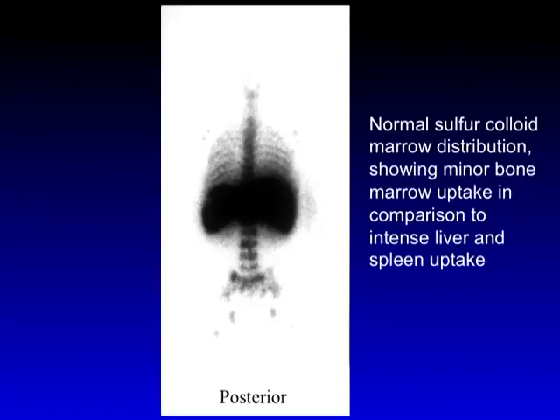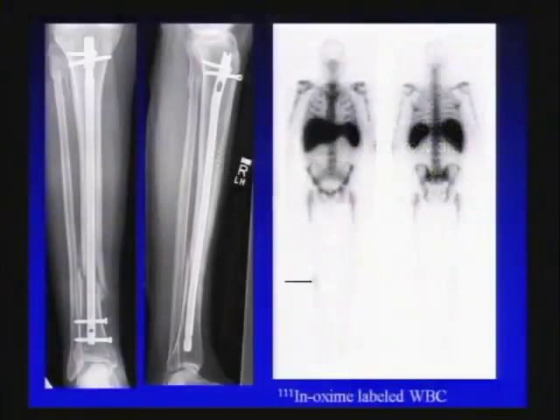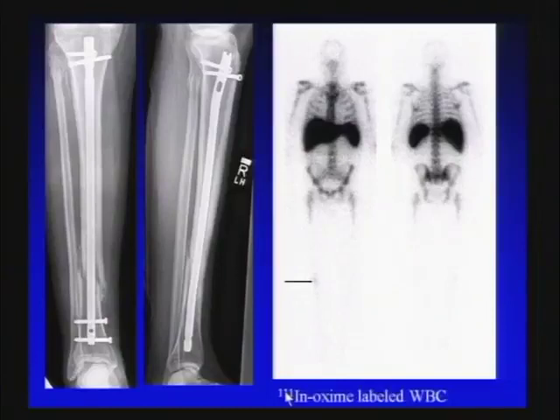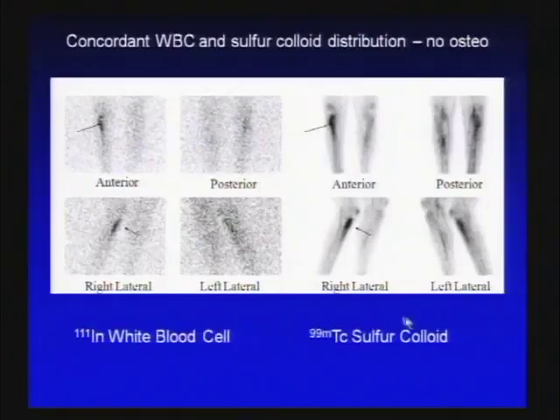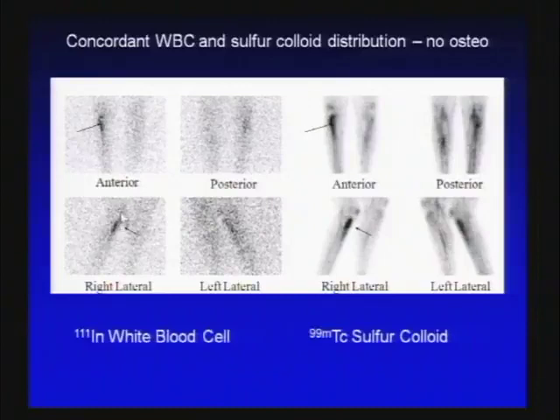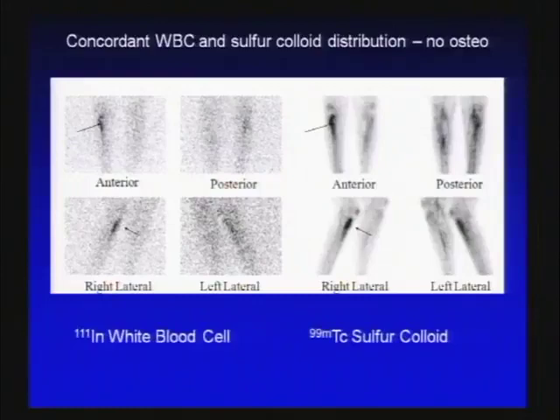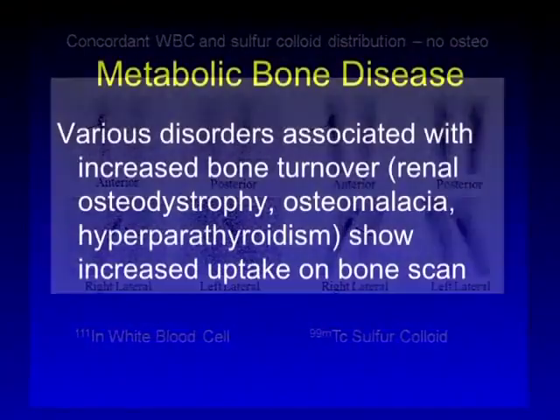Here's a reminder of the sulfur colloid red marrow distribution. On a white cell scan, we've got tib-fib fractures and an endoprosthesis with pain and fevers — question of infection. There's an abnormality with a lot of uptake in the proximal tibia, which is not where the fracture was, so we might think that's probably infection. But the sulfur colloid — done as a simultaneous dual acquisition — shows marrow expansion from the endoprosthesis. So there's nothing unexpected: that's a matching abnormality, which is fine. That's how you use white cell imaging — a matching abnormality is marrow; a discordant one suggests infection.